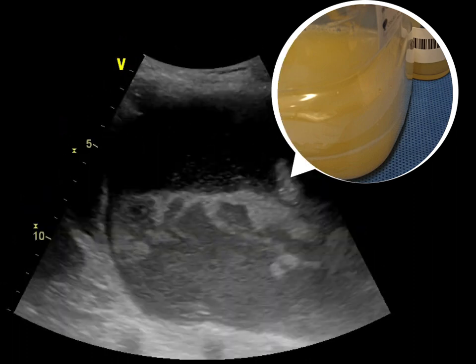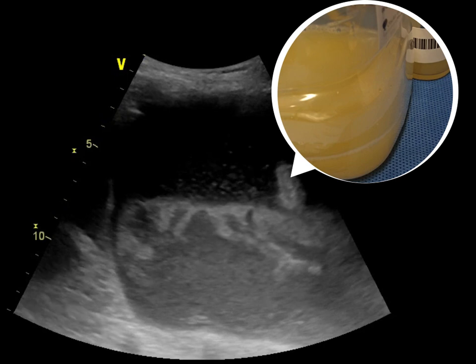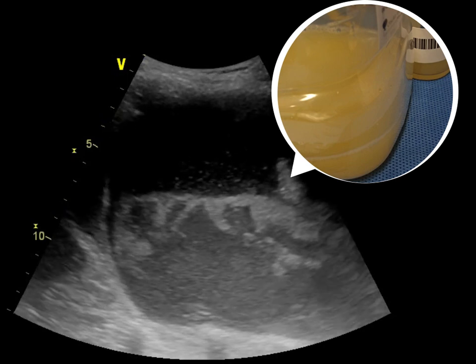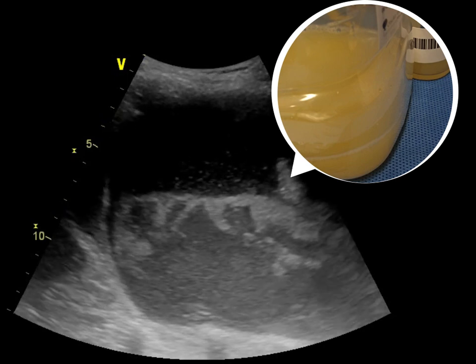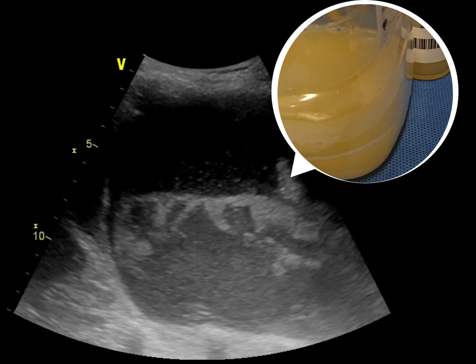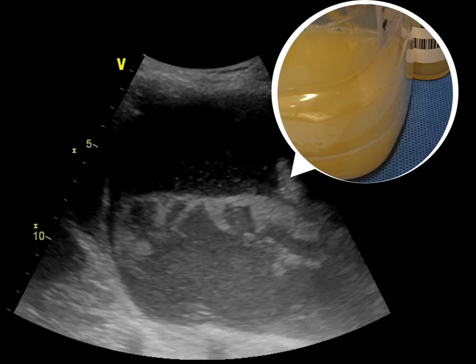We actually tilt the probe downward toward the patient's back, and this is what we saw. The content is very thick in appearance and obviously inhomogeneous throughout. When we drew the fluid by needle via a simple thoracocentesis, we found a very smelly fluid.